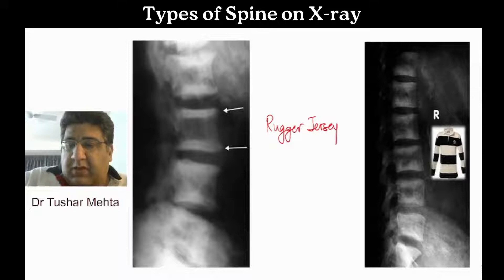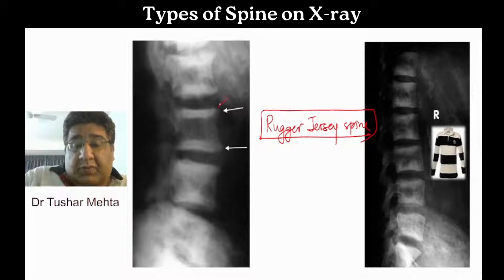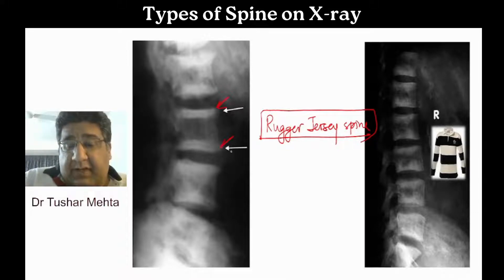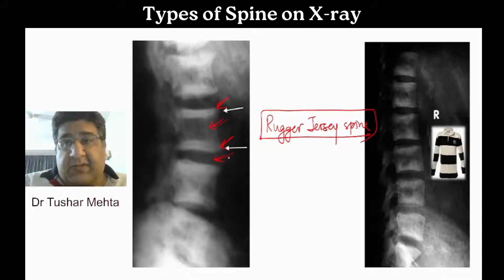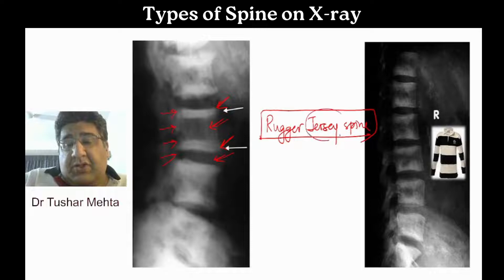This is what is called rugger jersey spine, where you can see that the superior end plate is dense and sclerotic, the inferior end plate is dense and sclerotic, the body is black, and the disc space is also black. So you see alternating stripes of white, black, white, black — just like the jersey of a rugby player.